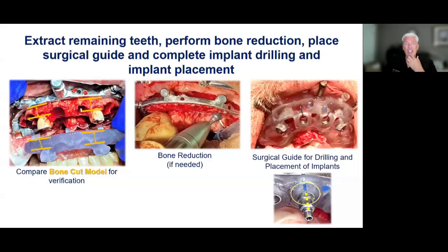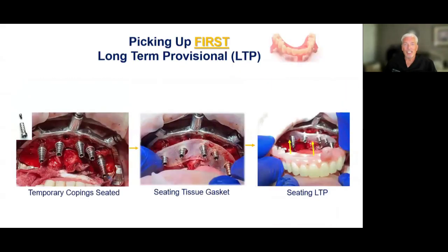Because you don't want to get the right bone in the anterior part of the alveolar ridge, but then on a wider ridge posteriorly, you didn't get enough. That could be a little awkward for the laboratory to make a good, functional, hygienic prosthesis for the patient. So now the surgical guide gets pinned in the same way the monostrut was, and then you do your osteotomies. There's your mark that we talked about on a regular surgical guide. So you have guided bone reduction and guided placement of the implant, with timing and depth control, which is key.